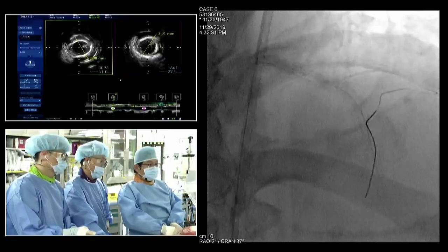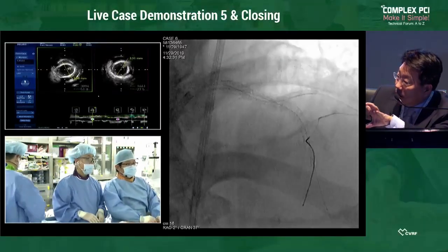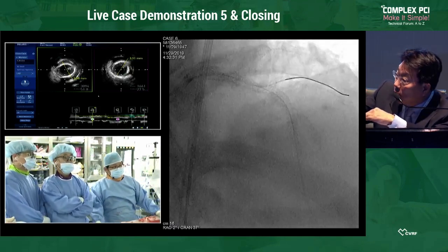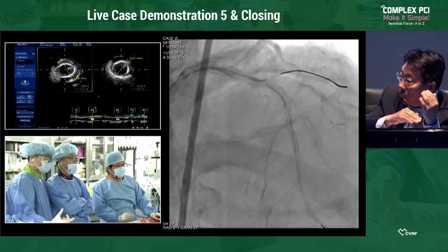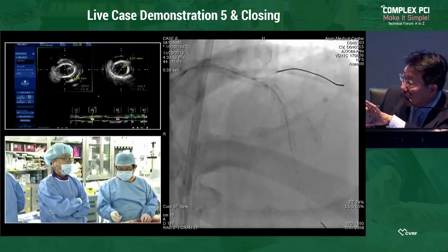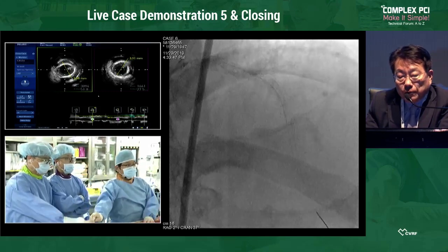Right. However, recent second generation stents can be modified. Even if we choose a 2.5, sometimes we can expand it to 3.0 or 3.2. If we choose a 3.5, we can make it 4.5, sometimes 5.2. So there is some worry about size discrepancies when choosing the stent, however, we can modify it more easily with high pressures.